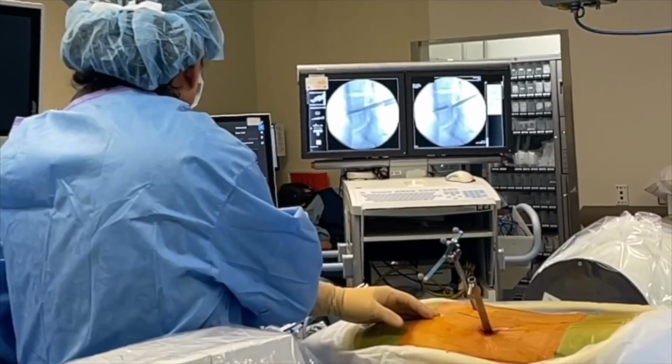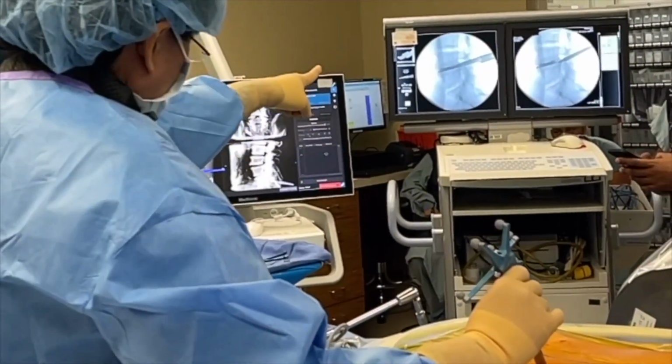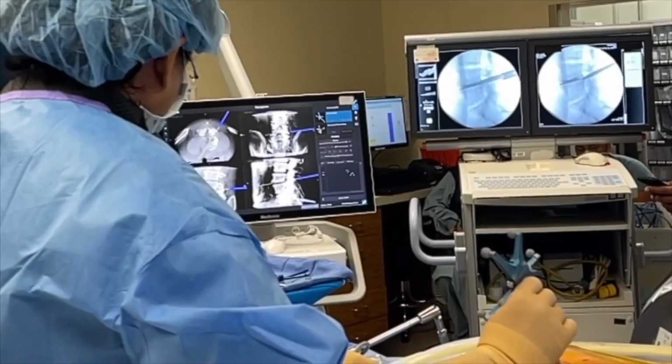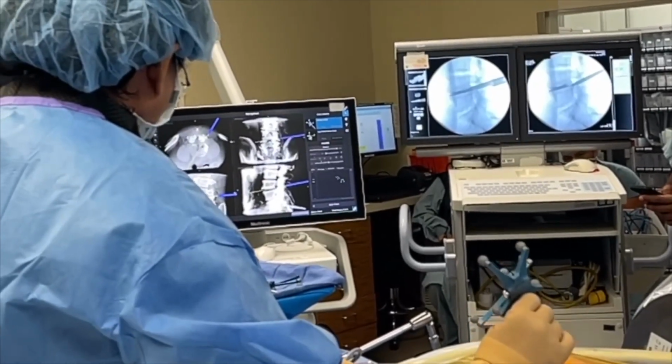Let me see the nav dilator. All right, so I've got the Wolverine in there. That's protecting the exiting nerve root. And it's hugging that huge overhang of the facet joint. It's perfect. I'm gonna just gently ream that out.